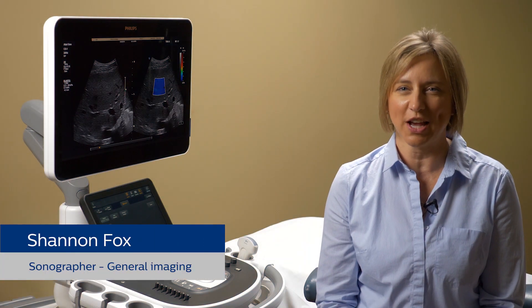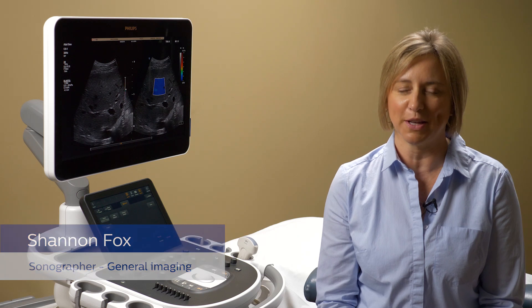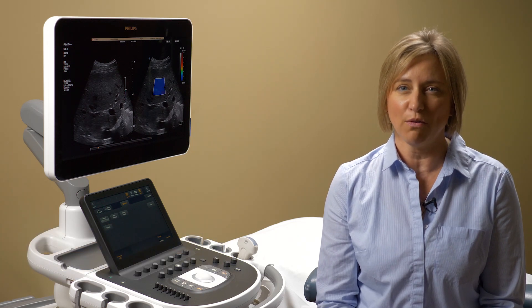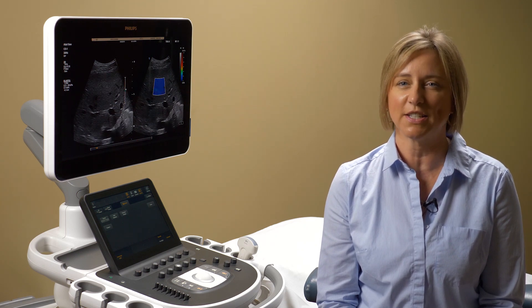Welcome, everyone. My name is Shannon, and I'm a sonographer working in general imaging applications at Philips. In this video, we will look at the four main steps for effective use of LASQ imaging for liver stiffness assessment.